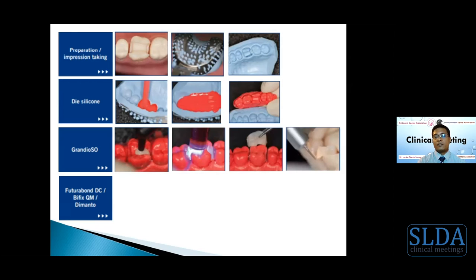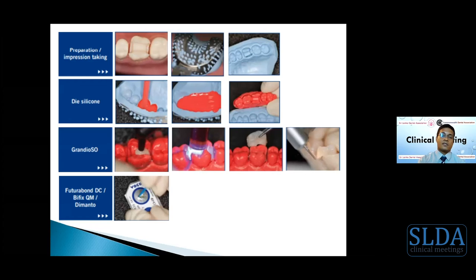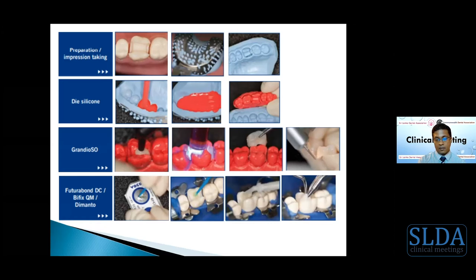And with the system, again, they provide you a conventional self-etching bonding agent and dual cure resin cement. So use them to bond it to the tooth preparation. Remove excess cement.